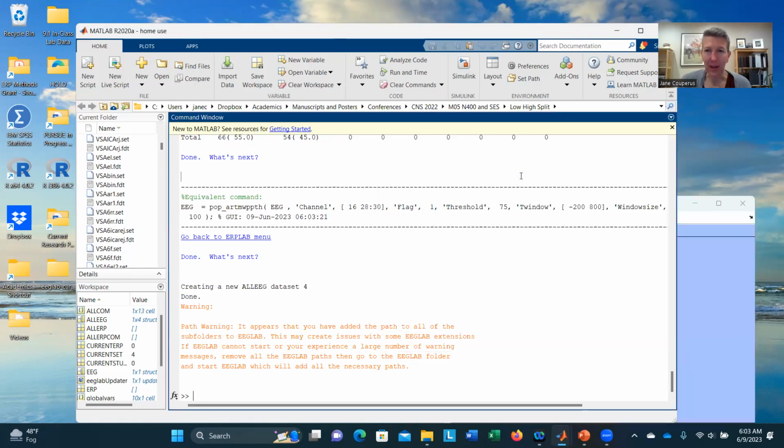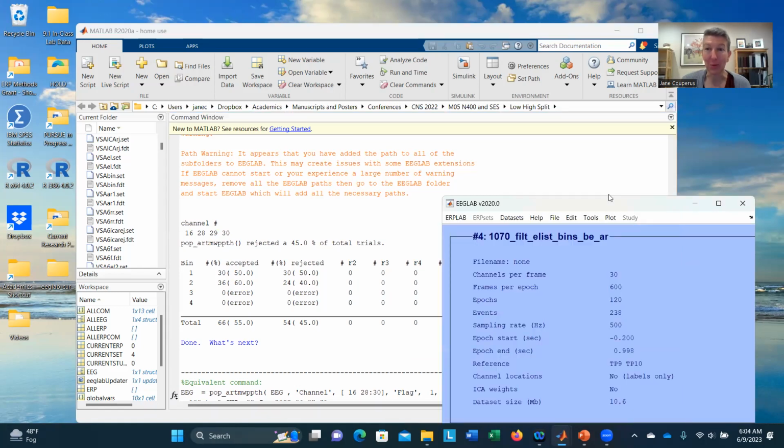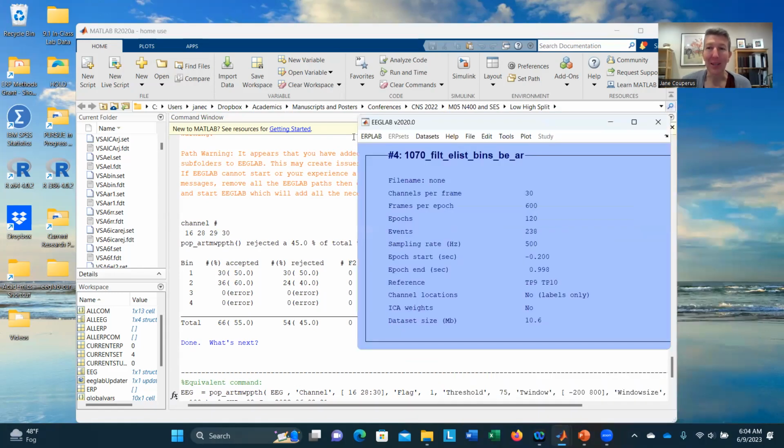So in our background now, if we look at our output, before we had 60 trials that were accepted for each. Now we only have 50% that are accepted. So this is the number of trials. This is the percent of trials. So number and percent, right? And it's rejecting 50% of our trials. So people are definitely having artifacts in these trials. It's just that they weren't during the stimulus period and they weren't being caught with that simple voltage detection. They are being caught with our moving window peak to peak.